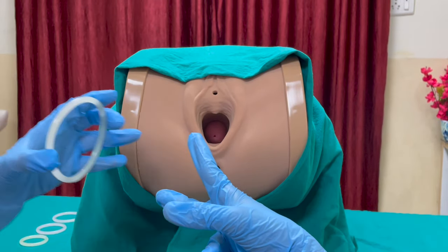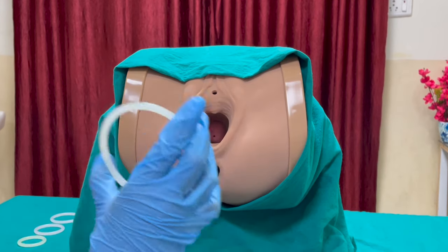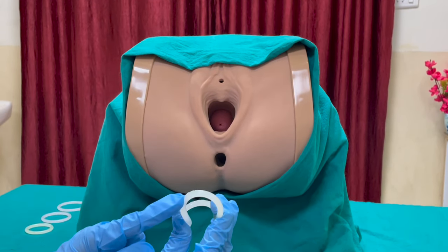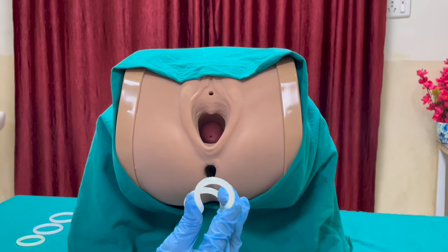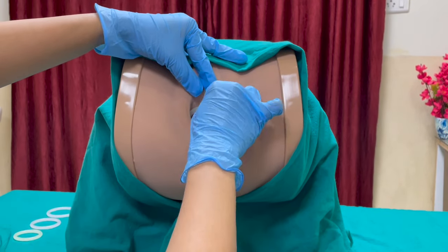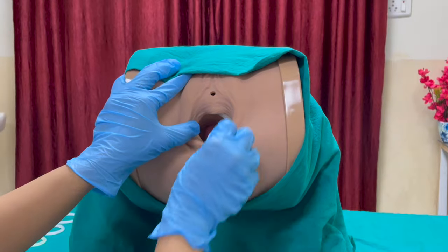The distance between these two fingers is the size of the pessary we are looking for. Get various pessary sizes and fit them in to see which diameter matches the width between the fingers. Once the size is fixed, the ring pessary can be folded in half. The entering end is lubricated slightly — not too much, because it might slip. The entering end goes behind the cervix, and the other end fits behind the pubic notch, the pubic symphysis.